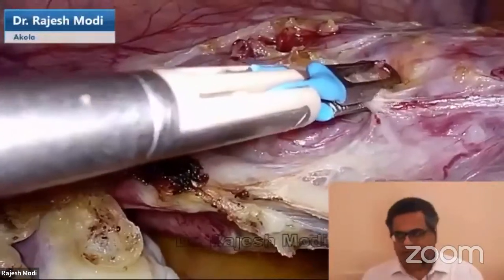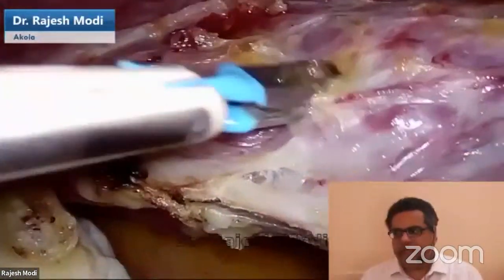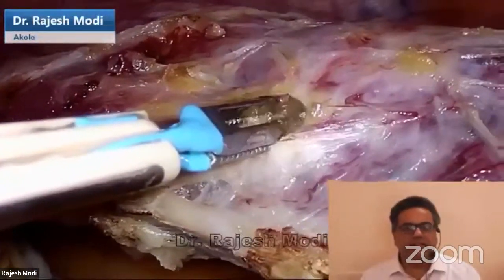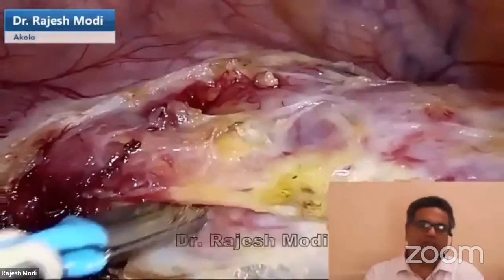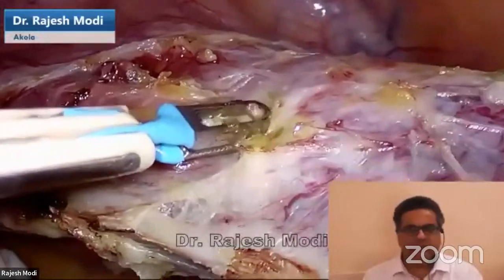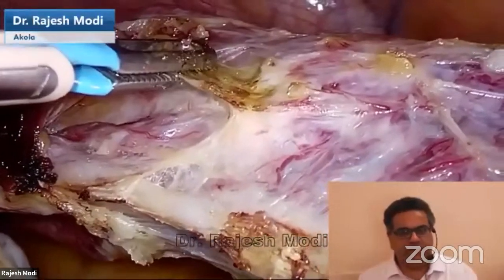You can identify the vessels very easily. And here you can see that we are pushing the bladder pillar down. This single step of further pushing the bladder pillar down isolates the uterine very nicely. It is what is called skeletonization of the uterine.